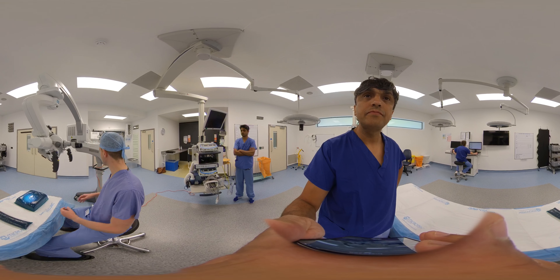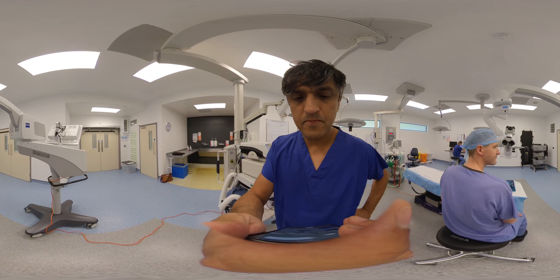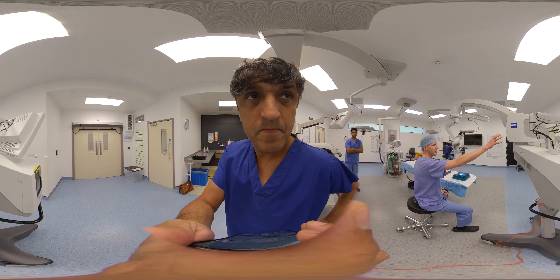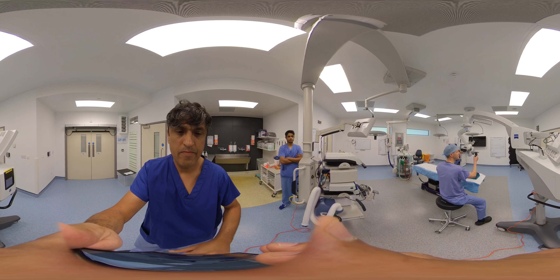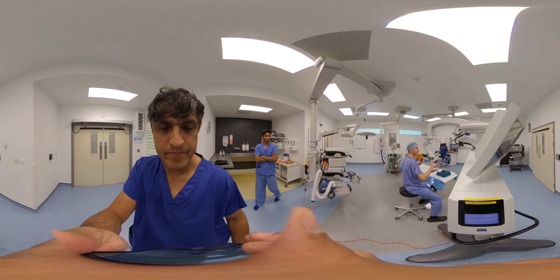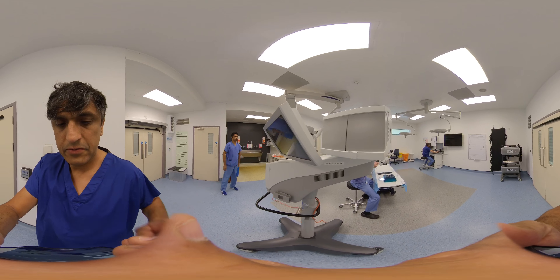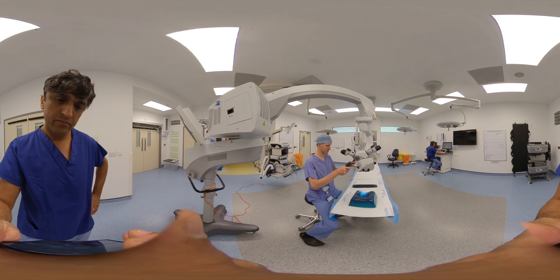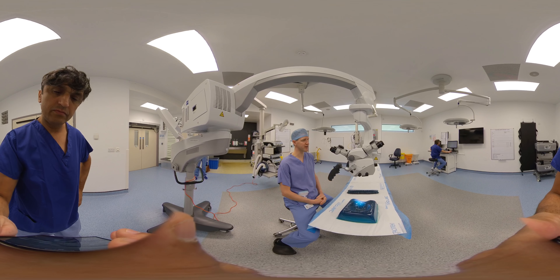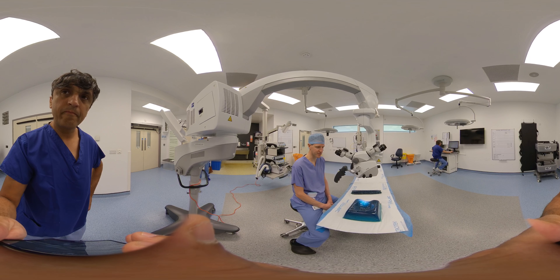When positioning the scope, we tend to bring it in at the top corner on one side of the bed so that you've got a break in the elbow of the scope itself, which allows you a bit more mobility of the eyepiece. Then just check that your eyepiece comes into the right position depending on where you're operating, so that you can get the setup correct and proceed from there.